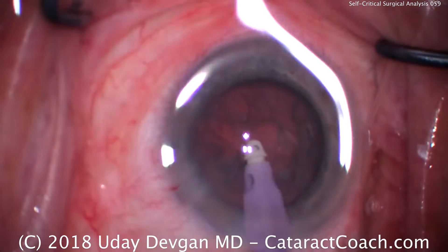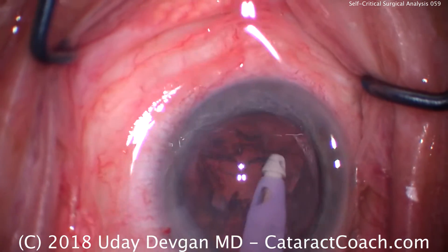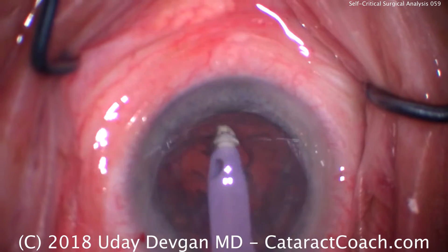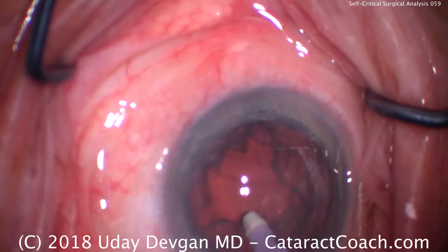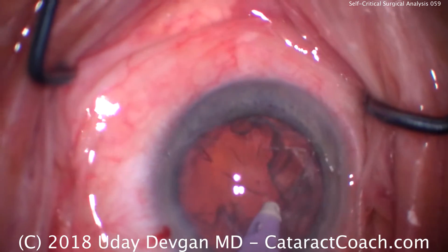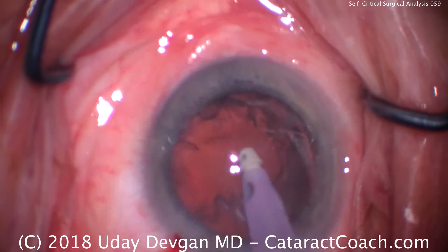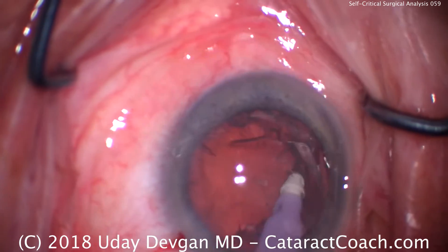Lots of fluid everywhere — why? Not the best draping, and a little bit of chemosis. So try to grab the cortex, but the cortex is being held down by an epinuclear shell. Try again, different quadrants — not having a whole lot of success here. There's a little bit. You can start to see this big thick epinuclear shell. There it is. Now try to get underneath this — that's probably our best bet.